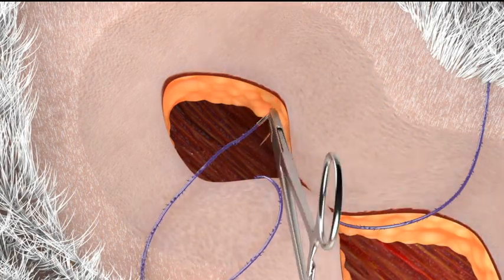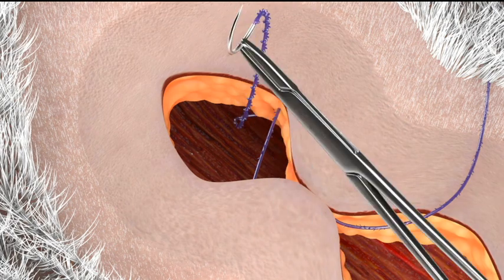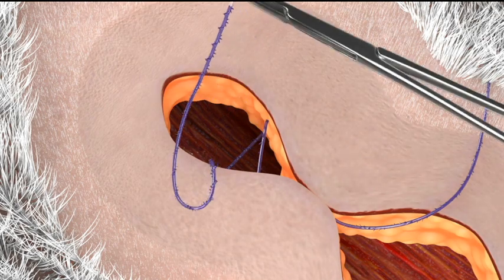You then proceed with the closure by running one arm of the Quill device in a simple running fashion through the same tissue plane. You will notice the even distribution of tension with this technique.